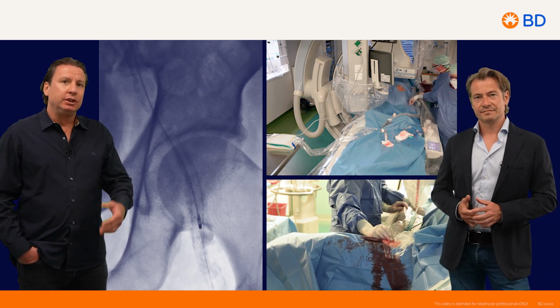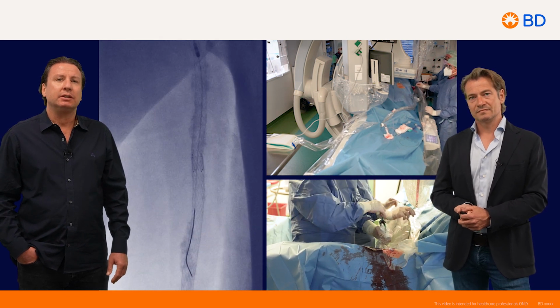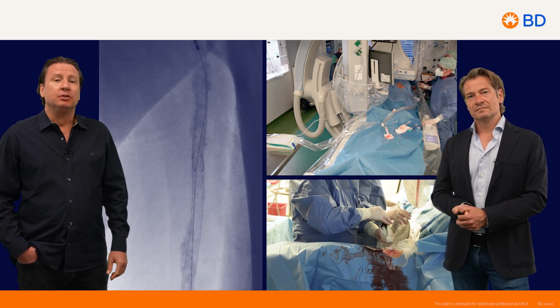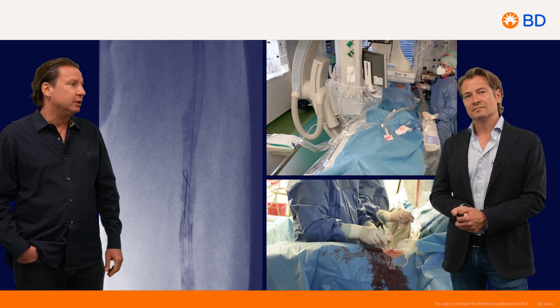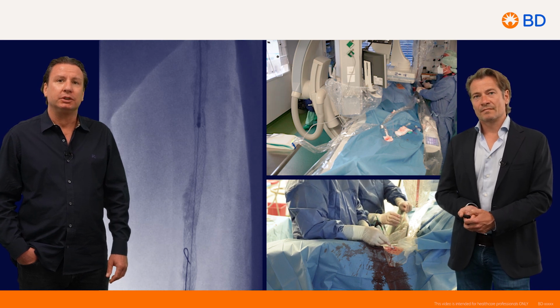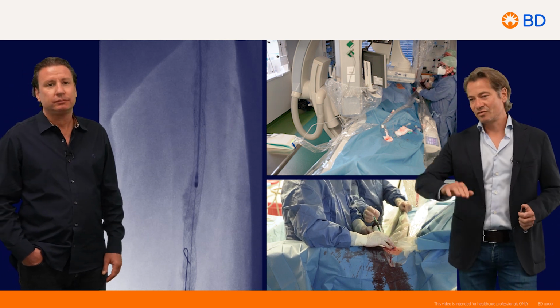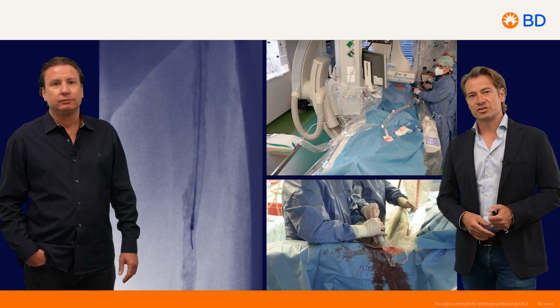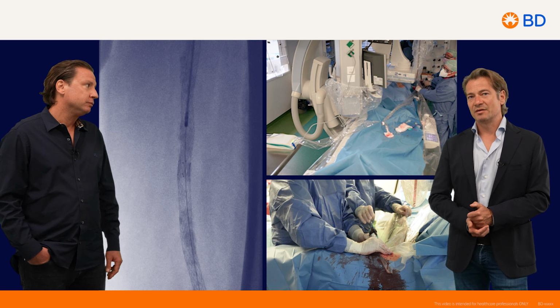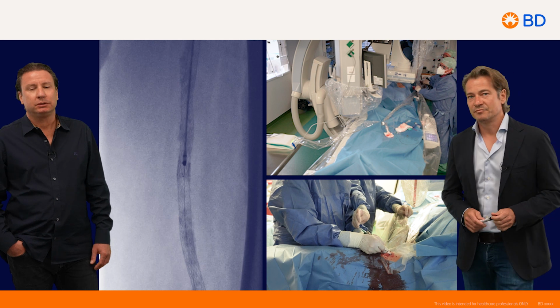So that's why we cleaned up first here proximally, and also here the in-stent high grade stenosis in the left SFA. You can see you can come relatively deep with the long 6 French Rotarex, even from the arm, as demonstrated here. It depends also a little bit on the size of the patient, and maybe also the morphology of the aortic arch and the iliacs. If you have kinking, then sometimes you cannot come very distal. Sometimes you can reach up to the distal third of the SFA, so you should measure it before.